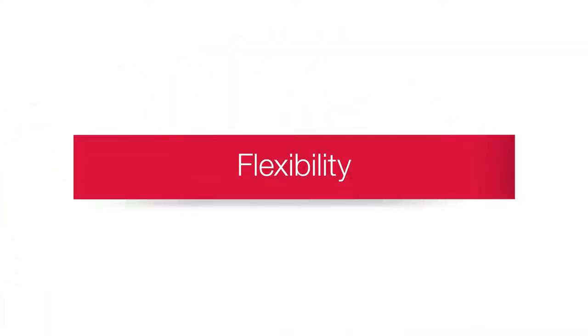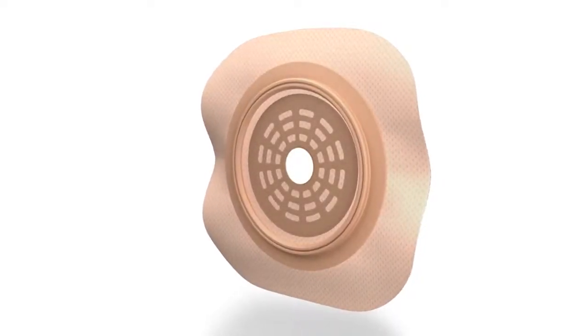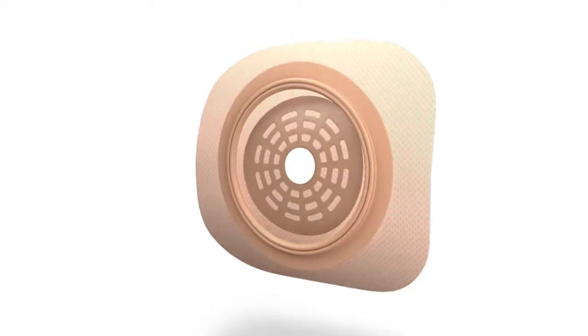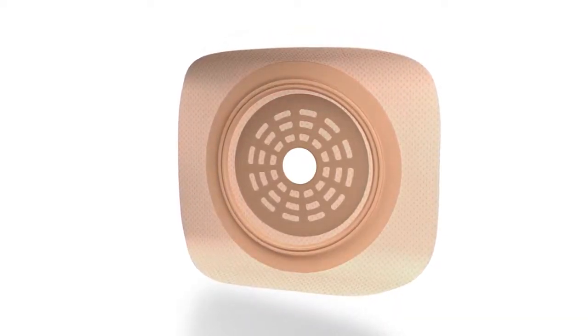The adhesive border barrier is formulated to be thin and flexible and to move comfortably with the body. This flexibility helps prevent edges from lifting due to moisture or motion, which helps to support desired wear time.